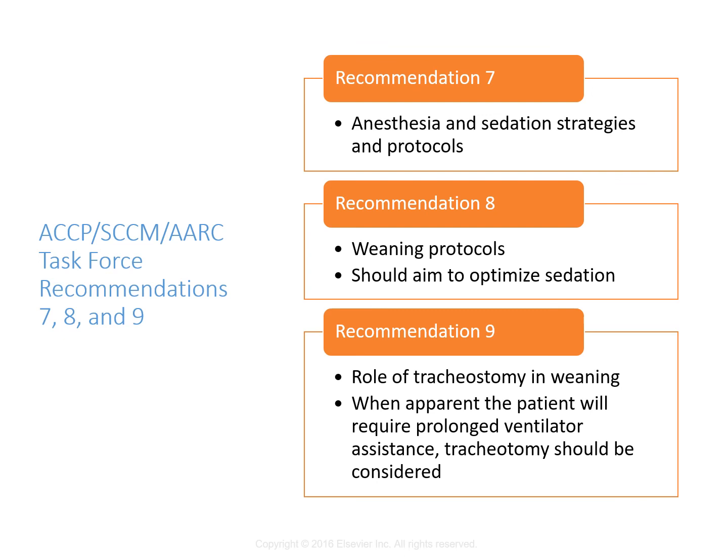So things you have to look at there, the tracheostomy tube, the big concern there is that it could take 7 to 10 days to really mature. And if it's inadvertently displaced, it comes out within 24 hours or something like that, then blind tube replacement is unlikely because that stoma can close up quickly and it can be very difficult. So it could be a very, very emergent situation.